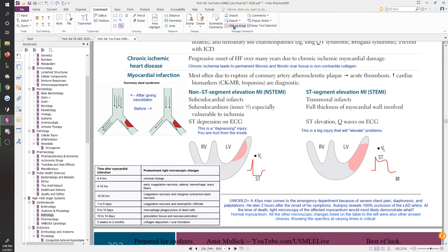So I always think of ST depression as depression, which is where you're hurt from the inside, right? In depression, the pain is inside. It's not like physical bodily depression where you have pain outside. So that's what you see in ST depression MIs, right? The N-STEMIs, which is a no ST elevation, which usually means it's an ST depression, has an infarct from the inside, only inside, right? So this is called a subendocardial infarct. Subendocardium, which is the inner 1/3, is especially vulnerable to ischemia because blood needs to pass through the entire endocardium to supply blood on the inside, right? So then that part just gets infarcted, and you see that as an ST depression.